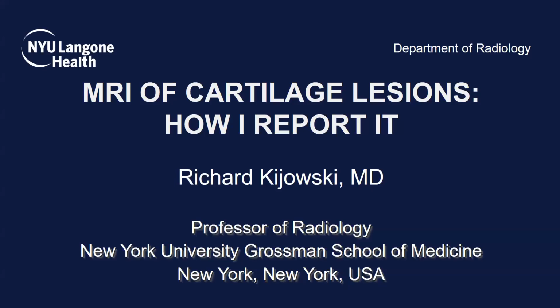Hello, my name is Dr. Richard Kijowski, professor of radiology at New York University Grossman School of Medicine. I would like to give a brief presentation on MRI of cartilage lesions, how I report it.